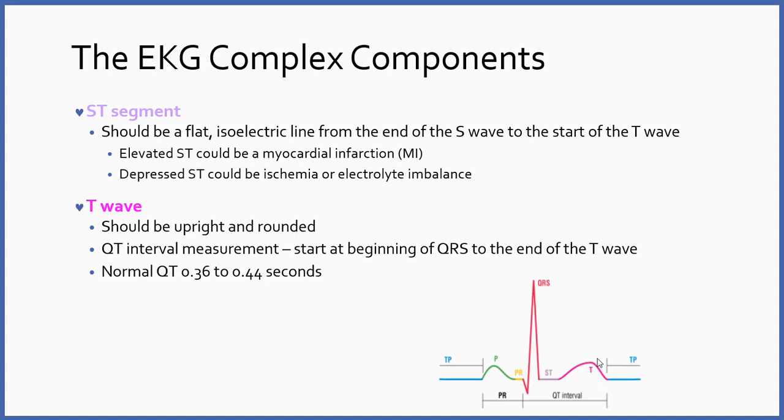And so if an ectopic impulse from the ventricle lands here, it will create a response, but a lot of times it's not normal. It's not what we want. It could cause the patient to go into a lethal dysrhythmia, most particularly torsades de pointes, which is a form of ventricular tachycardia, and potentially lethal, so we hate it when that happens. So long QTs are problematic. And there are many things that can cause that, which we'll be reviewing in class.